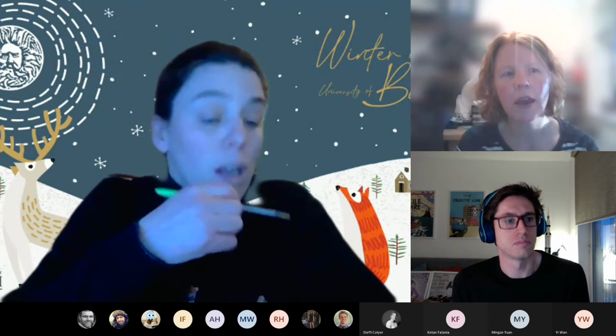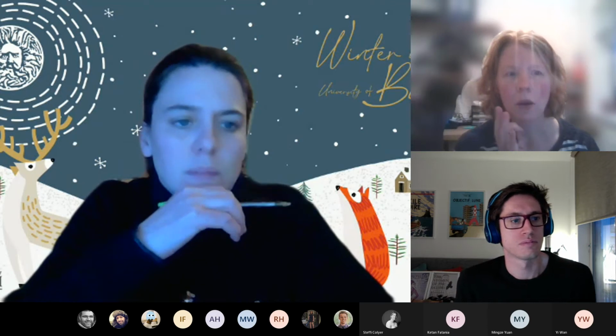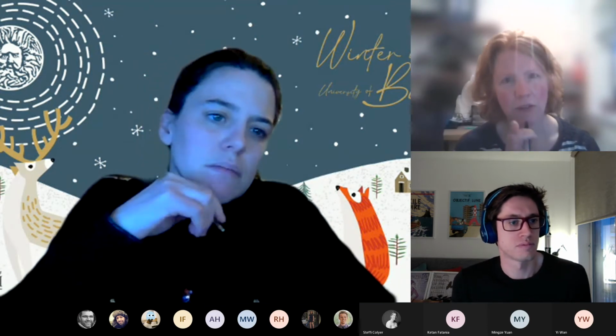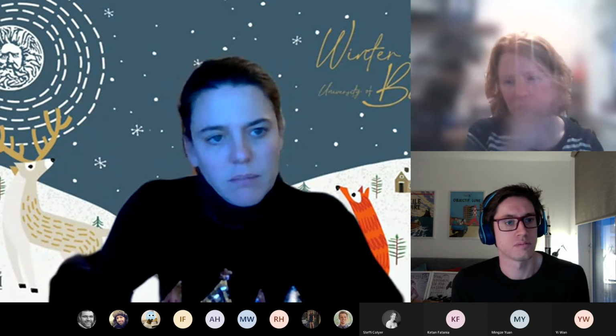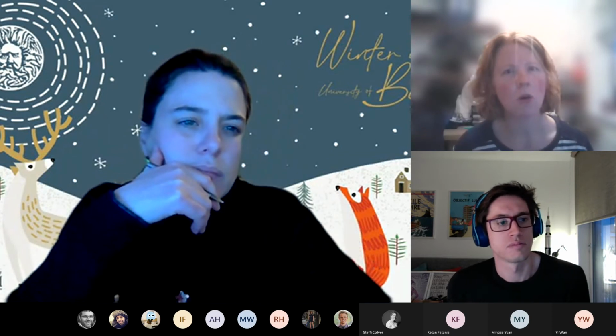Sure. So the twitch events happen over around 500 milliseconds, so they're much, much longer than the excitation events. With EMG, for intramuscular, we're typically sampling at about 5,000 hertz, because we're trying to capture events that are about 25 milliseconds long. But the resulting tissue response is much, much longer, and we're really looking at something more around 500 milliseconds.